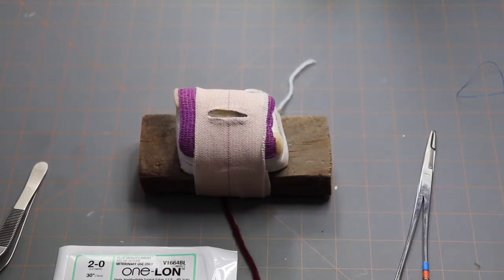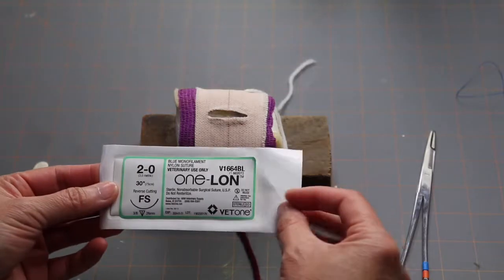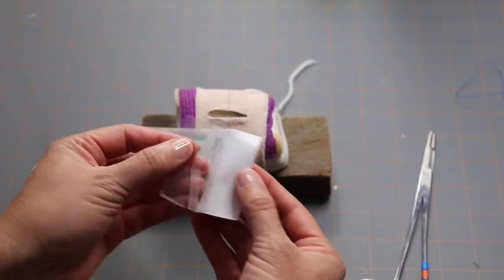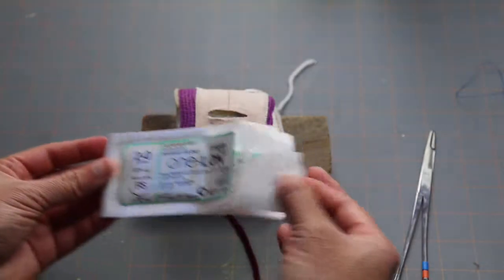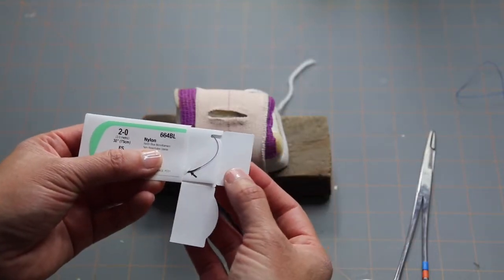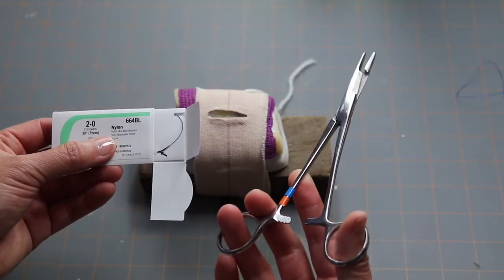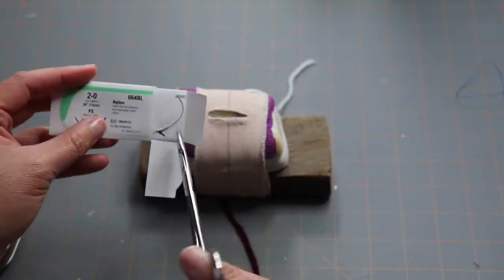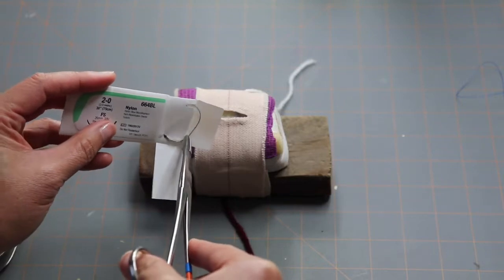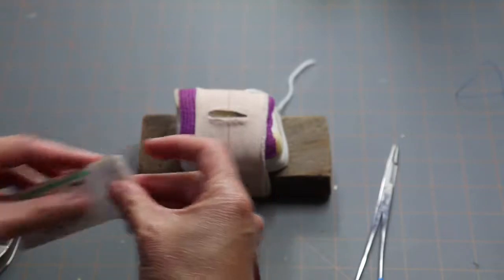Let's start suturing. Go ahead and open up your suture pack — you open it by peeling up these little flaps to expose the inner pack. Remove that, then move the flaps down to expose the needle and the suture. You're going to remove it with your needle holders — remember, hold your needle holders with your thumb and your fourth finger. Grab it with the tip of your needle holders and pull it out.